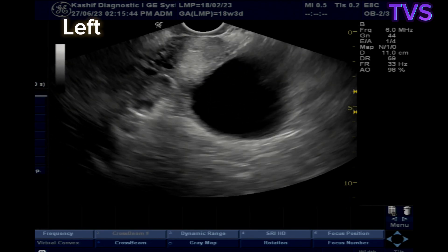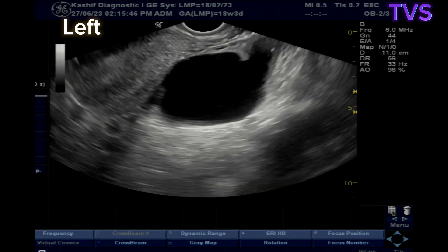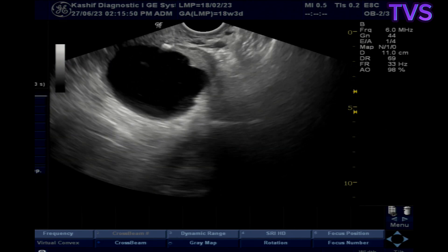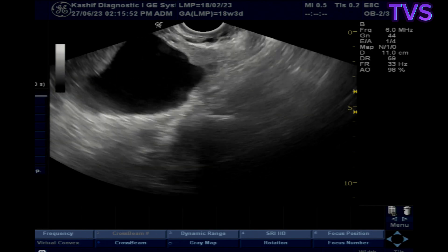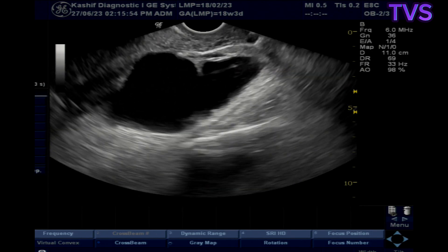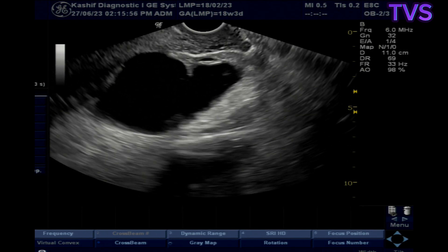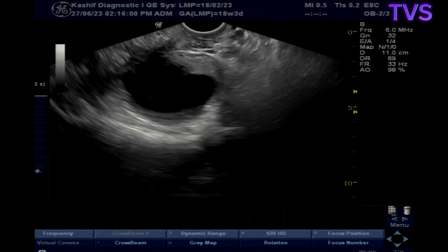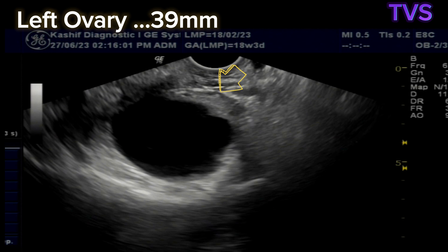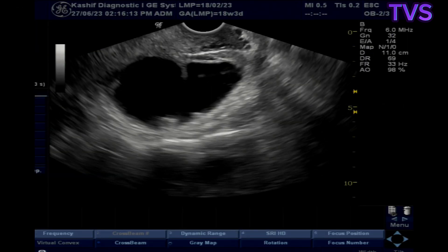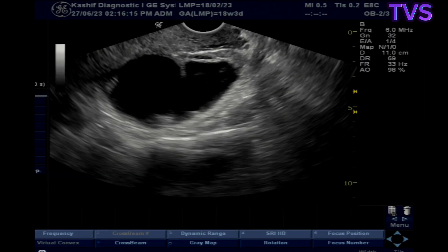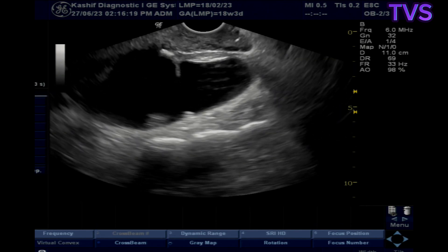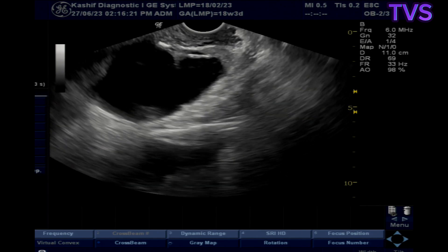In the left adnexa, we see a large elongated cystic mass. This is thin-walled with clear internal fluid. No calcification and no solid component are seen. The left ovary is visualized along the lateral margin of the cystic mass. The cystic mass is elongated and located in the adnexa with the ovary on one side.